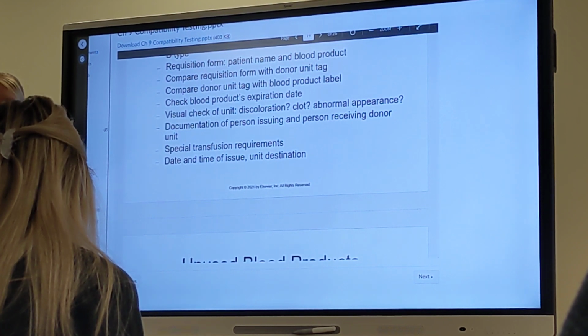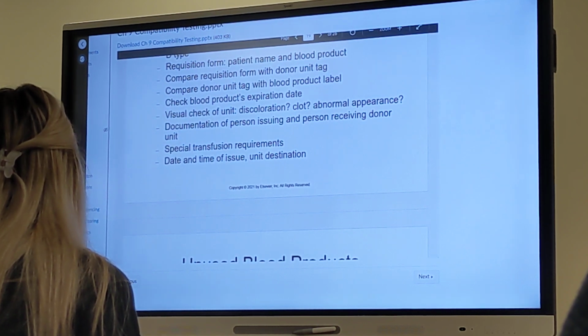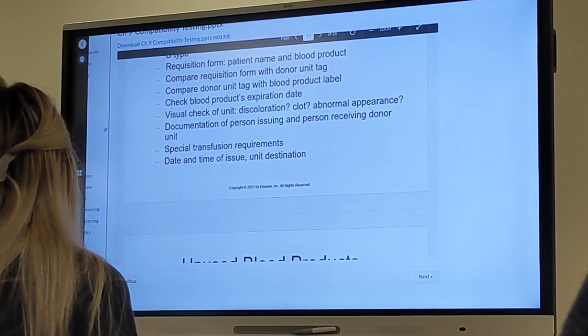They transfuse blood through a filter. The clot is going to clog up the filter, and then they're not going to be able to use that line. So if it has a big chunk in it, just put it to the side, you can't use it.